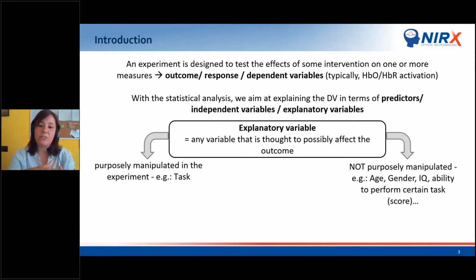When we recruit, of course, we follow strict recruitment procedures to limit as much as possible the variability across subjects. For example, we exclude subjects with a certain condition or outside a certain age range.